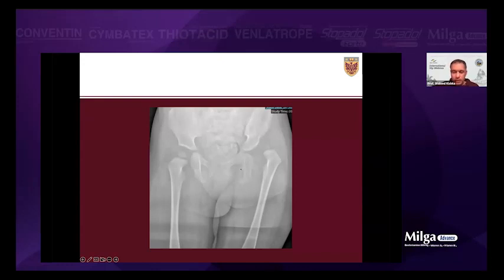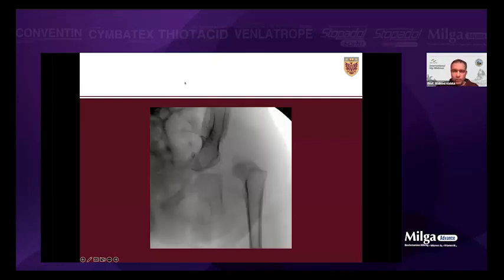And I also booked the spica table because in our hospital we have to book the spica table. So this is a patient in the OR with a fluoro. I examined the hip before we start the opening, and I did examination under anesthesia. I found the hip is actually reducible when I asked the anesthetist to give muscle relaxant, just avoid the word paralysis, but this is what we use here. And I found the adductor tendon is very tight, so I planned for adductor tenotomy. Do you guys do adductor tenotomy open or percutaneous with a needle?